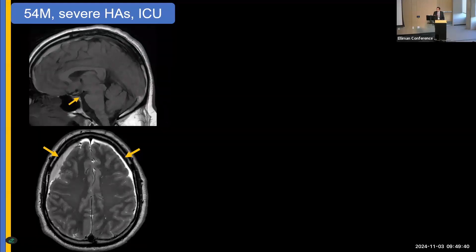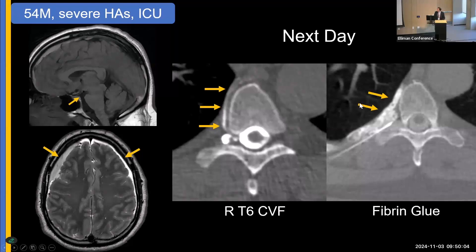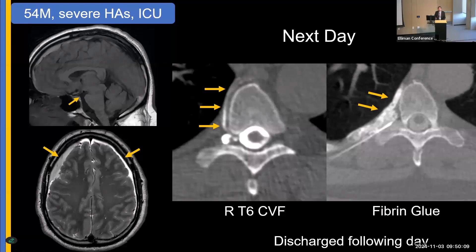This is a recent patient who presented to the ER — a 54-year-old with severe headaches — and was sent to the ICU. You can see the bad brain sag and the subdural collections with blood. This was day one of the admission. On day two, we did a decubitus myelogram, found the fistula, and in the same session did a fibrin glue patch. The next day, he was discharged. That illustrates the power of how much we've advanced in the field.